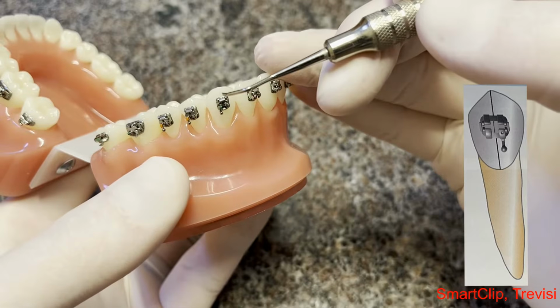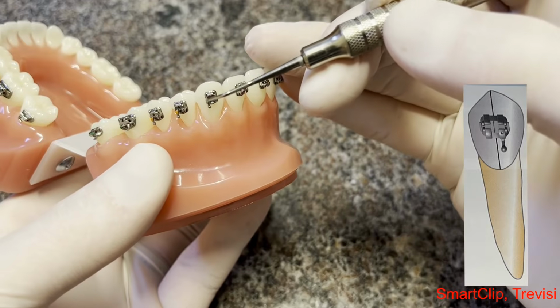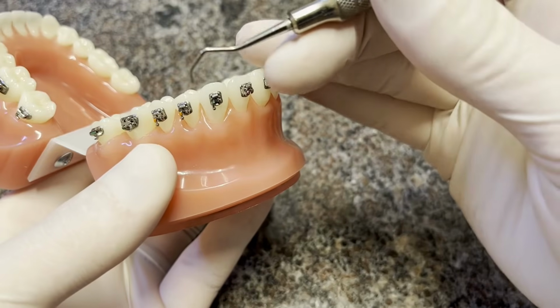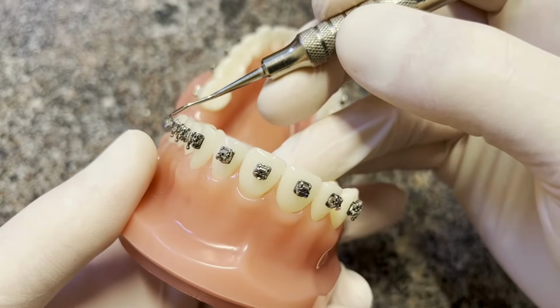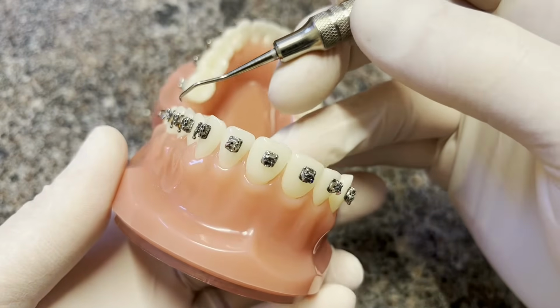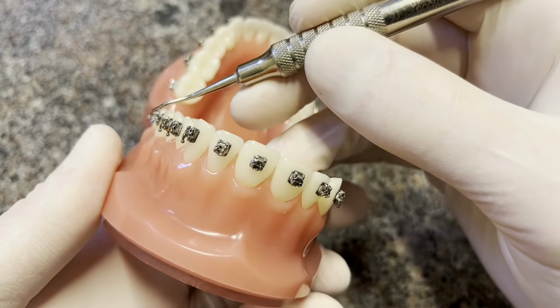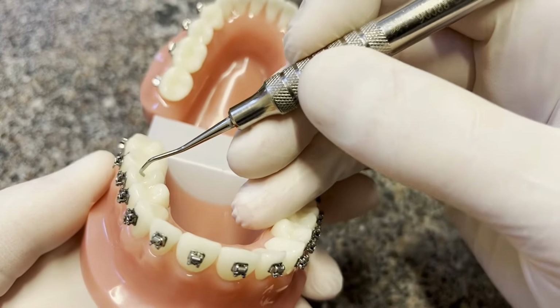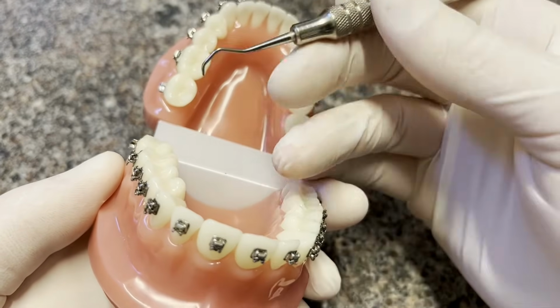What I mean by the long axis is, picture if the root was here and you drew a line that went straight down that crown and then straight down the root, that's the long axis, and you want this to be parallel to that. And the height right here, so the height of these premolars, you want to kind of look down the barrel of that 6, the tube on that, and you want these 4s and 5s to be lined up with that if the marginal ridges are level. If the marginal ridges are off, you want them to be high or low to that imaginary line connecting these slots. So if this one was 1 millimeter high, you would want that bracket slot to be 1 millimeter high to that imaginary line, if that makes sense.